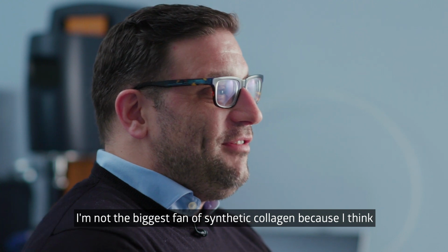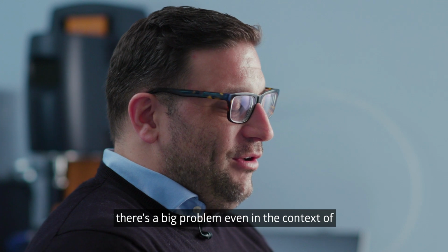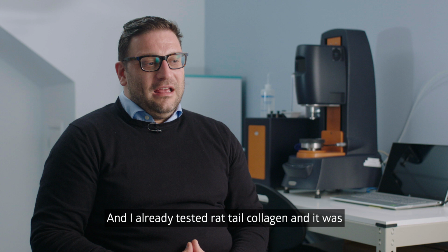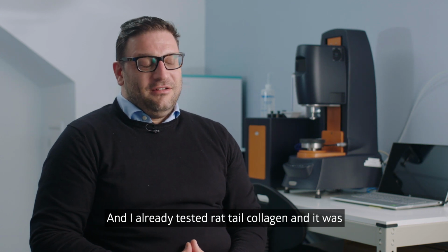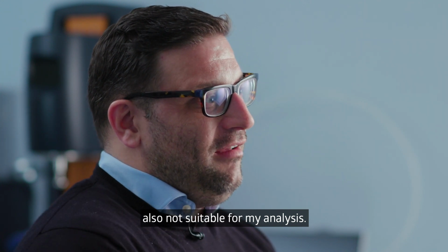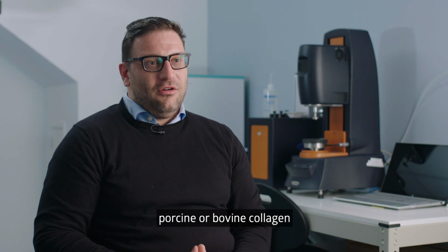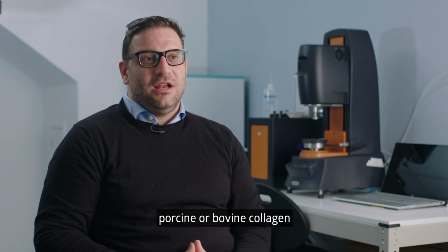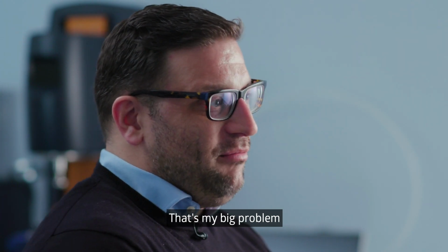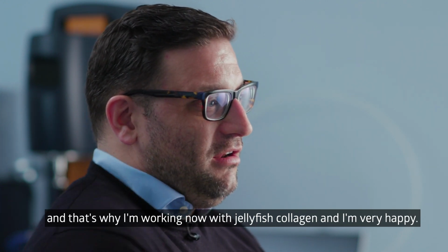I'm not the biggest fan of synthetic collagen, because I think there's a big problem even in the context of the analysis of inflammatory reactions. And I already tested rat tail collagen, and it was also not suitable for my analysis. And I'm not the biggest fan of porcine or bovine collagen, even because there's no homogeneous quality of the collagen. That's my big problem. And that's why I'm working now with jellyfish collagen, and I'm very happy.